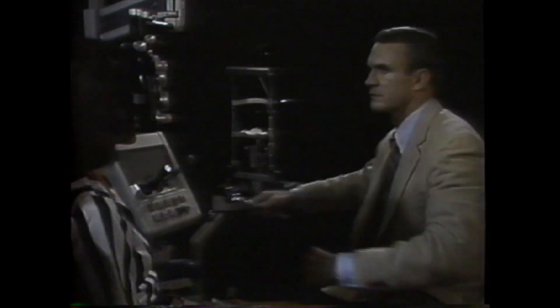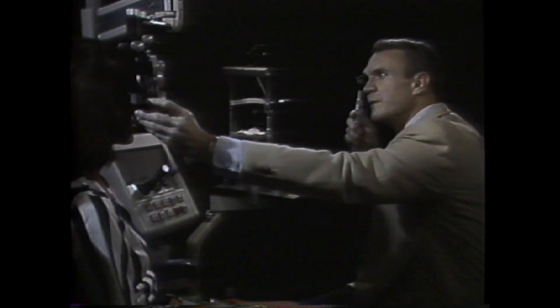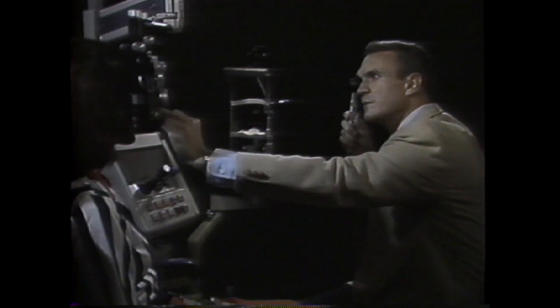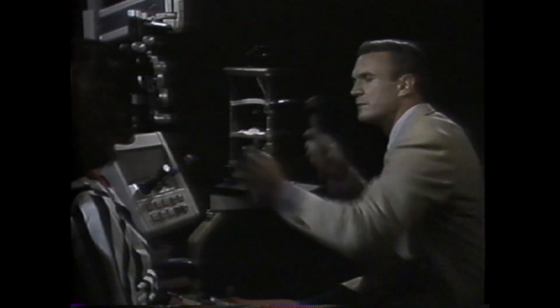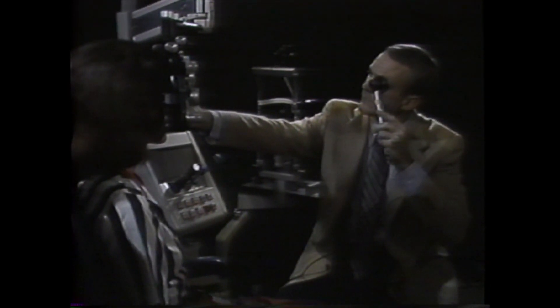Learn to retinoscope the patient's right eye with your right eye and the patient's left eye with your left eye. This allows the patient to look past your ear with the eye not being retinoscoped at a small fixation light at the end of the room. You need to be as close to the patient's visual axis as possible for the best accuracy, and if the patient does not have strabismus, using the other eye for fixation is the best way to achieve the proper alignment.